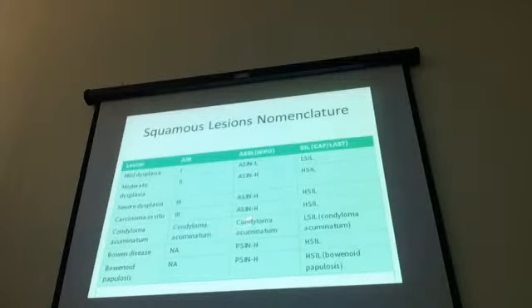And then if we have the architecture or whatever, we can call it a condyloma and so forth. And for the perineal or perianal skin intraepithelial lesion, these are high grade. We can't really tell these apart, even though the clinical presentations may be different. This in a young woman, this in an older patient.